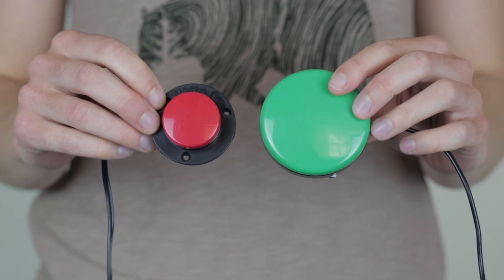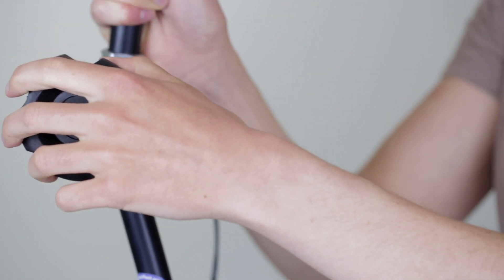The Spex switch is a little bit smaller than the Buddy Button but it requires the same amount of pressure to activate it.